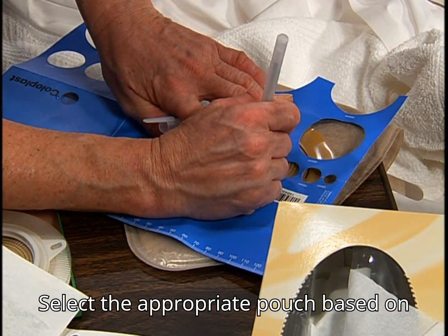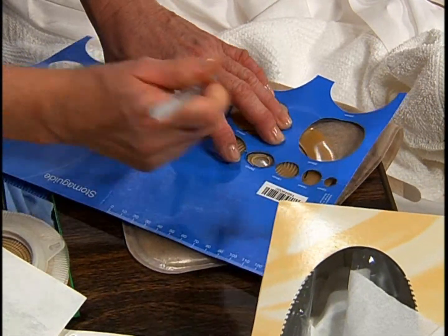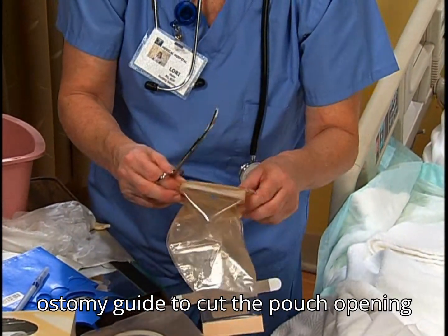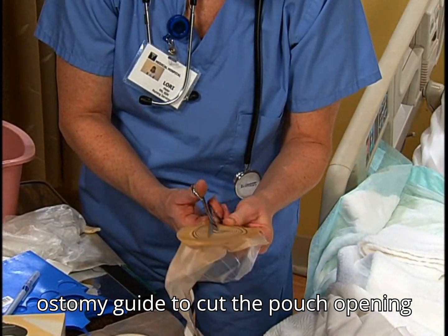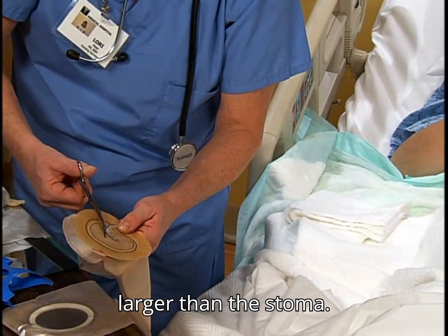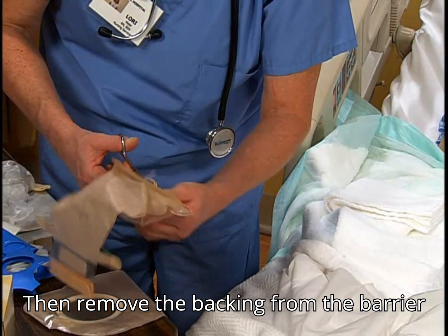Select the appropriate pouch based on your assessment findings. If the patient will have a custom cut-to-fit pouch, use an ostomy guide to cut the pouch opening 1/16th to 1/8th inch larger than the stoma. Then remove the backing from the barrier and adhesive.